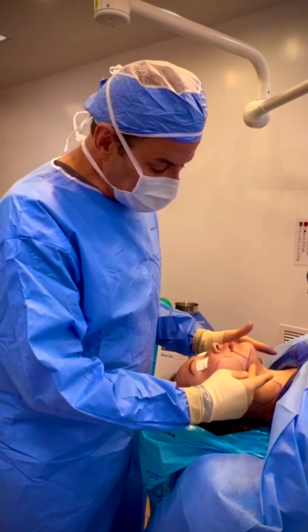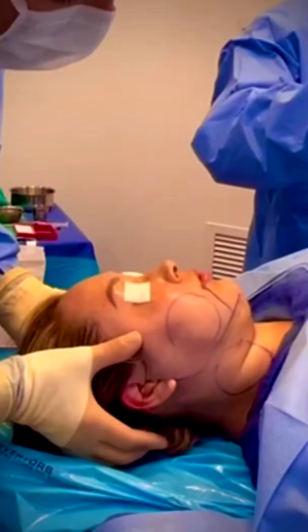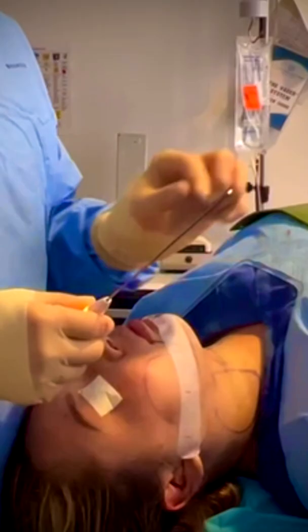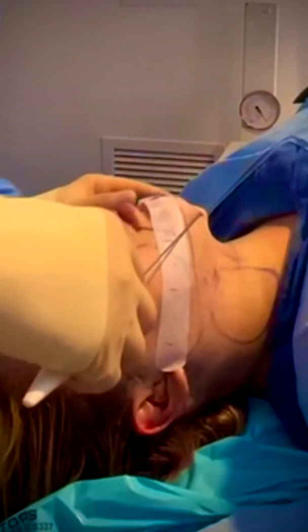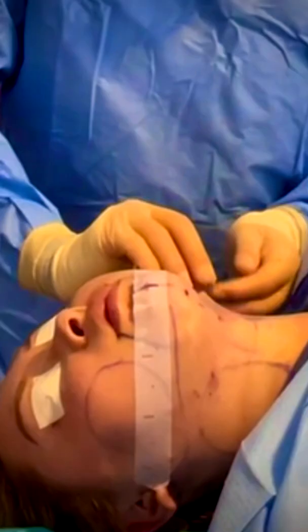Our last step now — we're getting ready to do MyElevate, but I just want to show you the neck contours before we do MyElevate so you'll see what it does. You can see how that kind of drops down underneath — let's just remember that. Now we're doing the MyElevate procedure, which is the final step — sort of like the icing on the cake. We're going to use the lighted needle and thread — the thread is attached to the middle of this needle — and we're going to pass it underneath her skin. That's going to give her the snatched jawline. We just basically go right in the center here, the light shows through the skin, and we're just going to pass this underneath the skin from puncture to puncture to puncture.